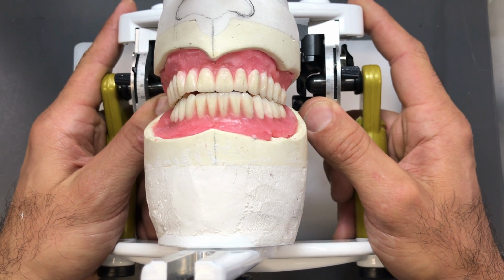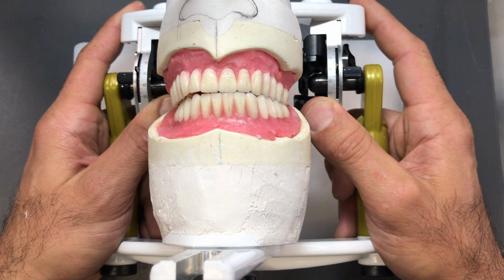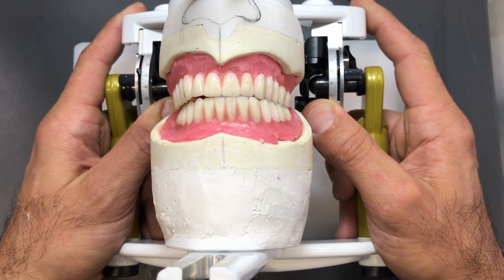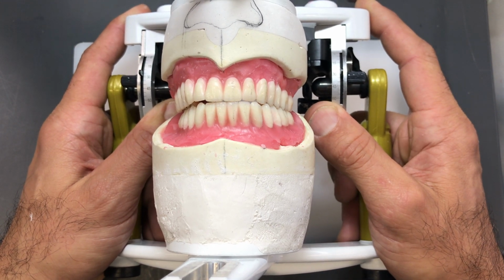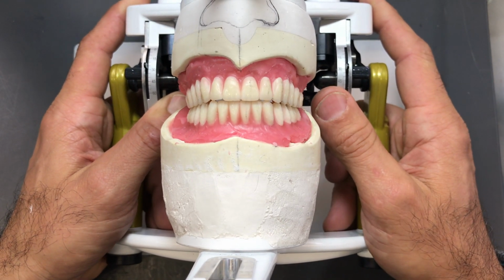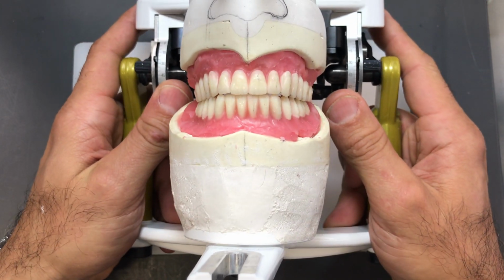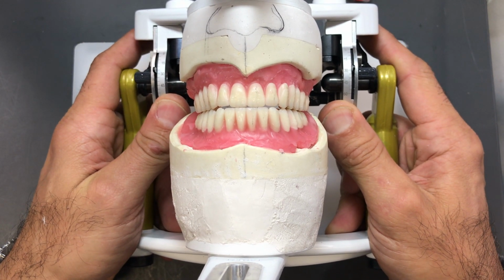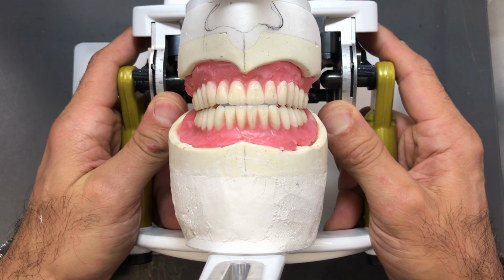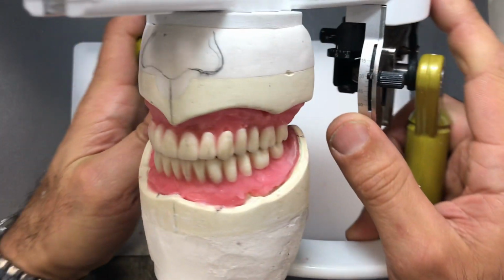And again, I have left working and right balancing contacts, as well as incisal contact between centrals and laterals, a little bit better with the 2-2 against the lower 3-2 and 3-3. And finally, when I move the articulator straight out, I should have incisal contact just like that between the centrals, as well as posterior, just like we had before, on either side.